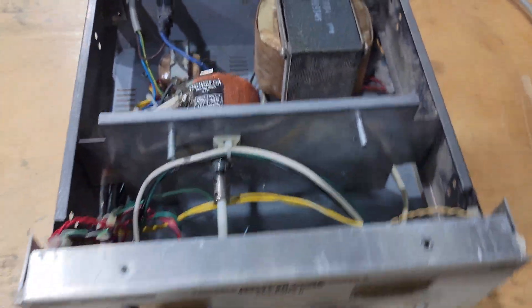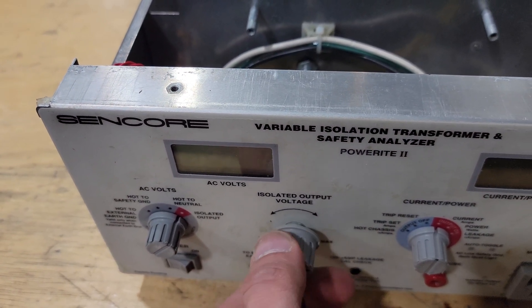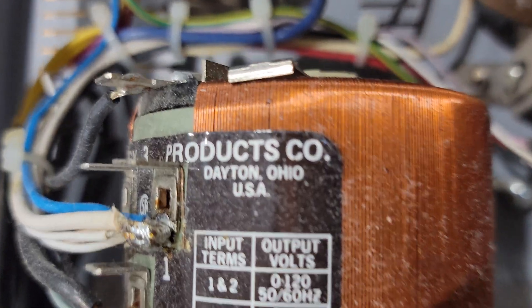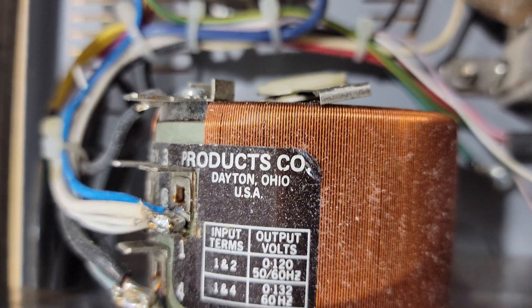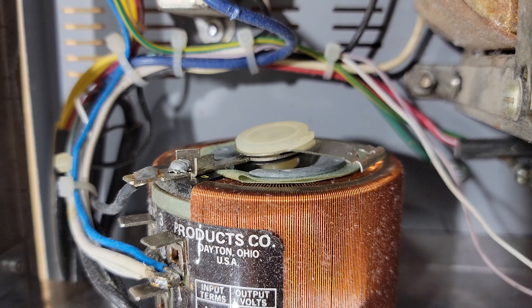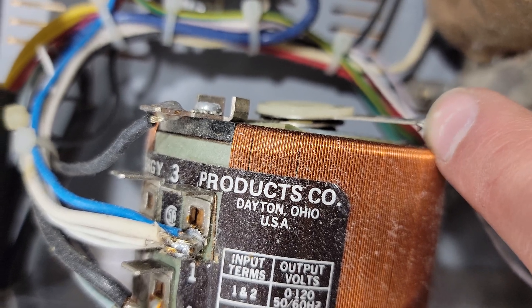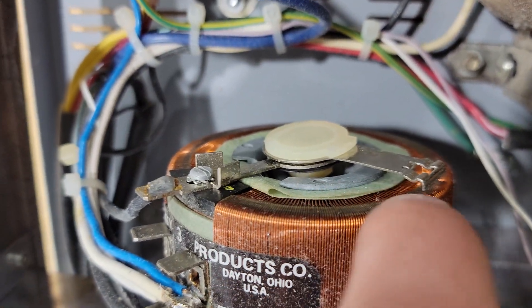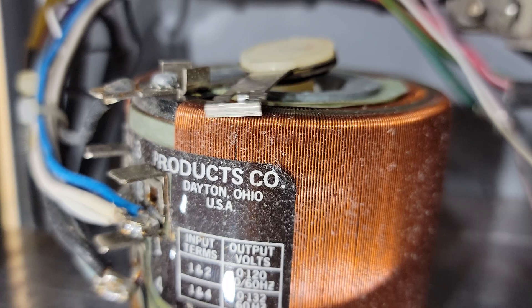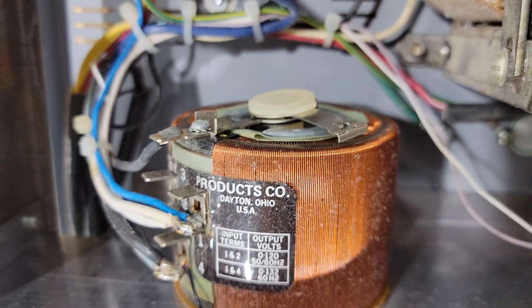I took a ton of screws off and wanted to see what was going on. When you turn this knob here, it turns a Variac in the back. You can see it's not making very good contact with the coil. That pin you can see right in there should be touching the very top of this coil of wire. When it does that, it makes the connection and is able to actually adjust the voltage. So I think we're going to need to fix that.